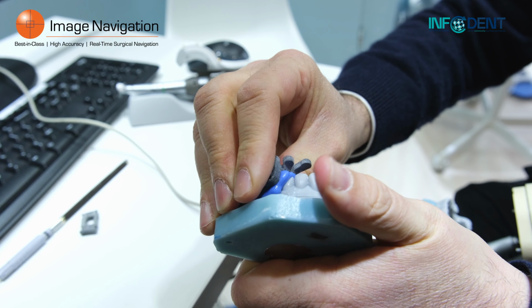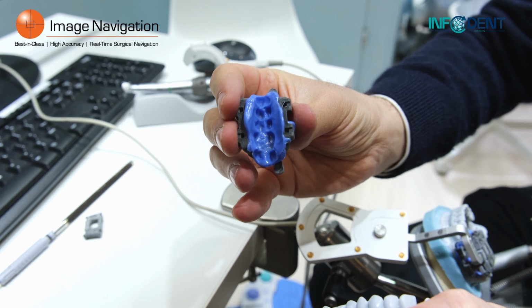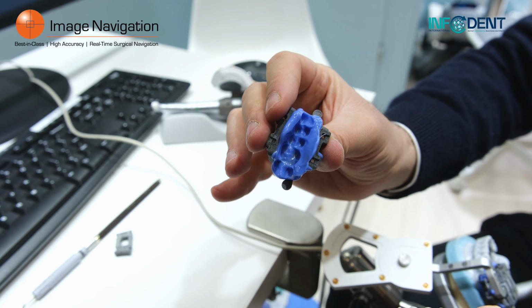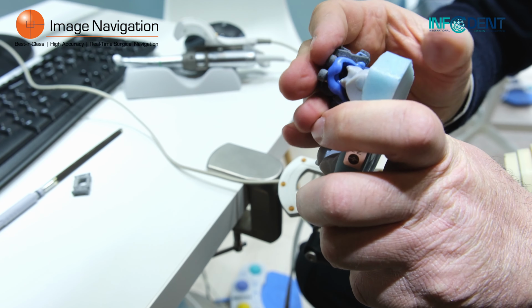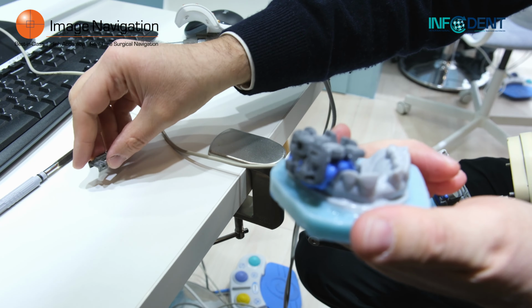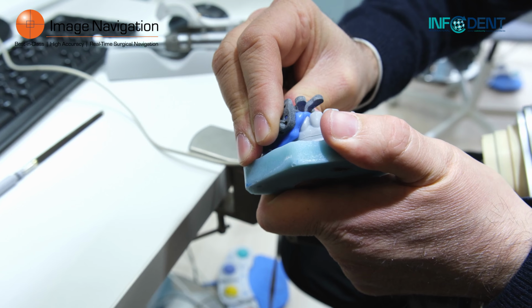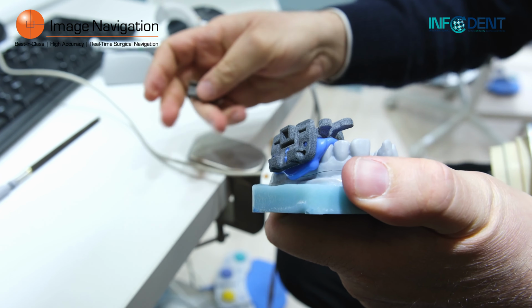Let me remove it. You can see it's just a very simple impression that any dentist can do, placing it into the jaw. Even though it's not bad, we can still see a rocking motion.